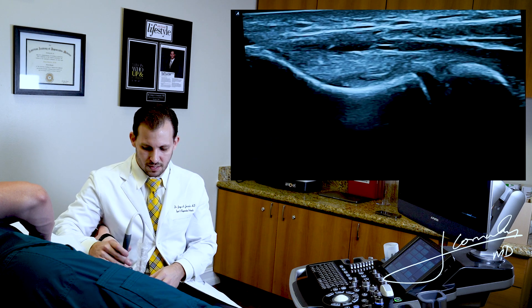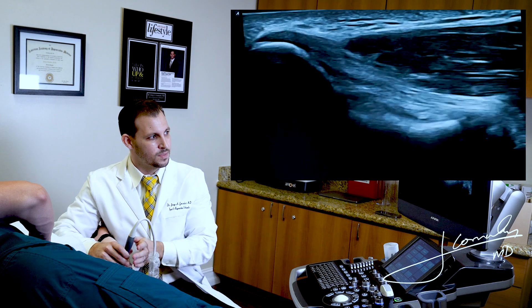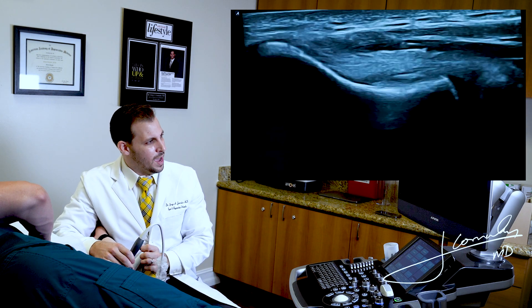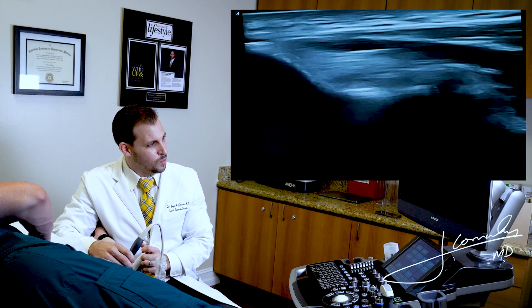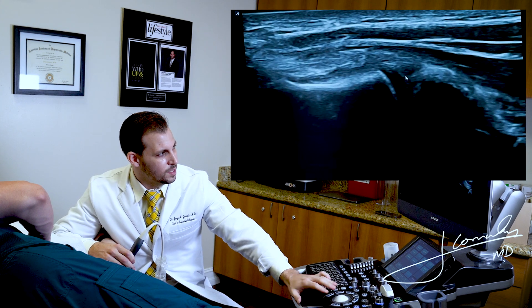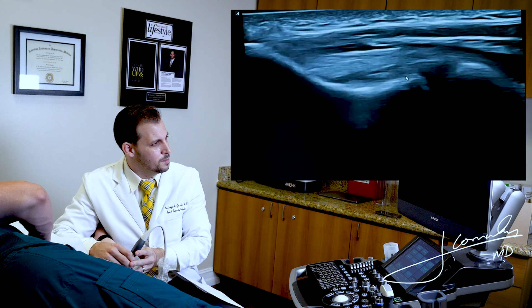The other thing that we could do at this level is dynamically stress the UCL. Again, we want to anchor ourselves into that same image and concentrate on the ulnar humeral joint space, which is going to be this one right here. I'm going to get a better image of that.